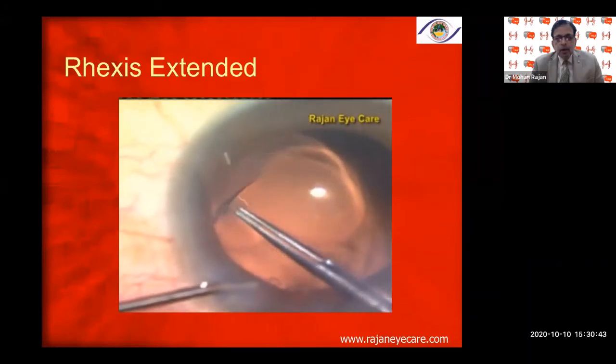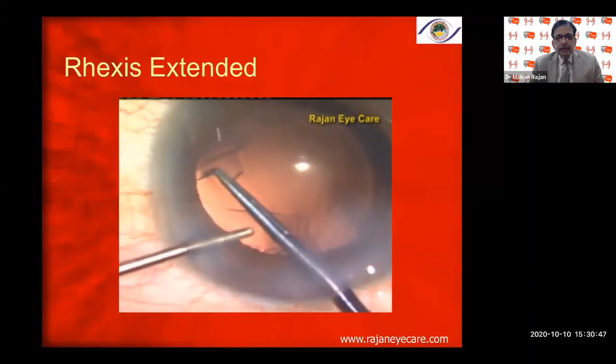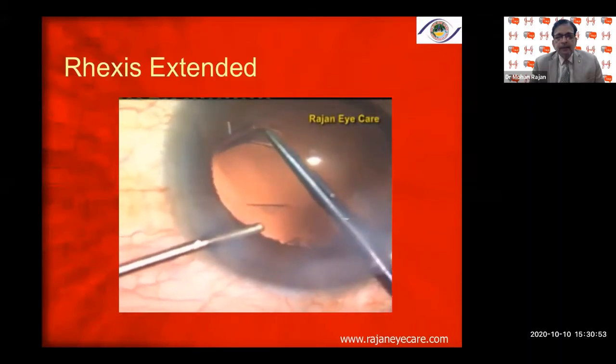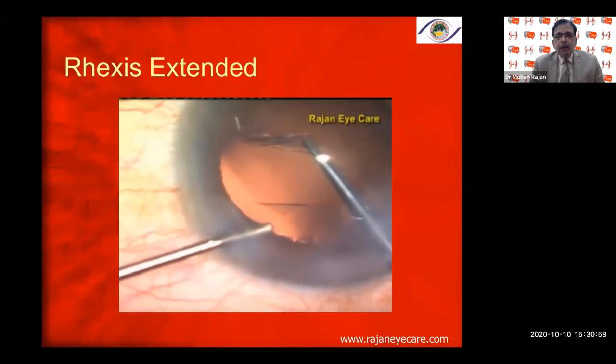In another patient with an extended rhexis, I try to catch the rhexis, complete it by making a nick, and pull it inside. You have to make sure that you pull it inside and towards the center, with good viscoelastic support.